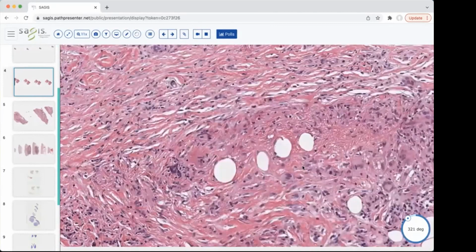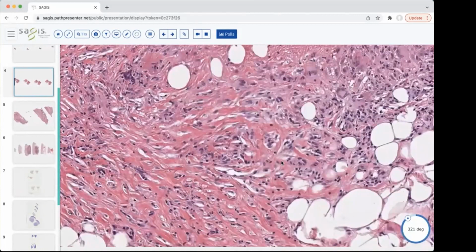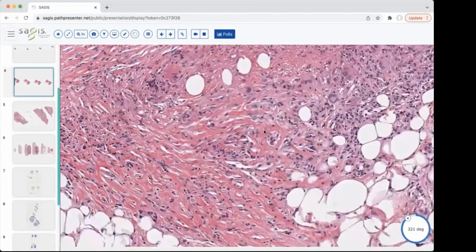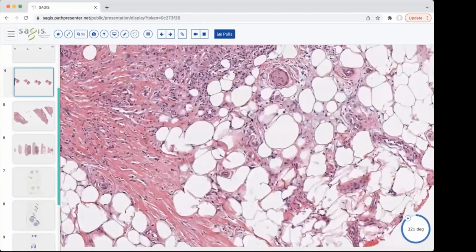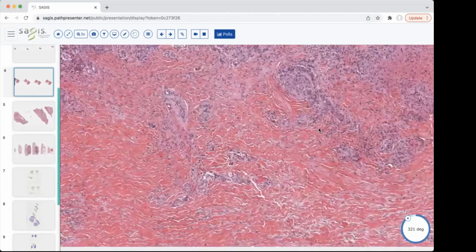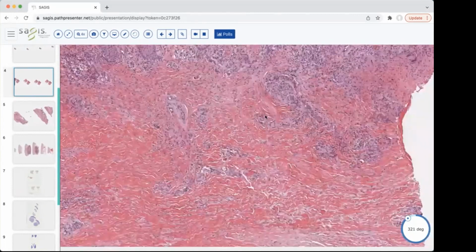But the cells that we're looking for are plasma cells. There are some studies that have shown that plasma cells occur more commonly where this dermatitis likes to occur on the body anyway. So it's not entirely clear whether it's driven by the rash or driven specifically by location. But this inflammation, this dermatitis will normally have plasma cells.